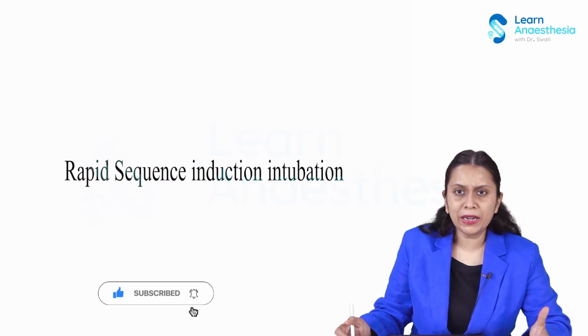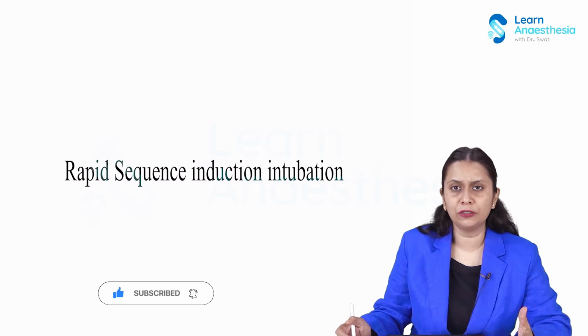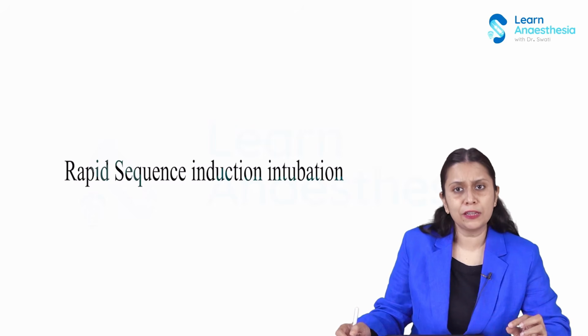So from induction to the inflation of the cuff, there is a risk of aspiration in the patient, because when you induce someone, the airway reflexes which protect us against aspiration are lost. And in patients who are more at risk of aspiration, we need to practice a technique which protects against this aspiration. And that is rapid sequence induction intubation.